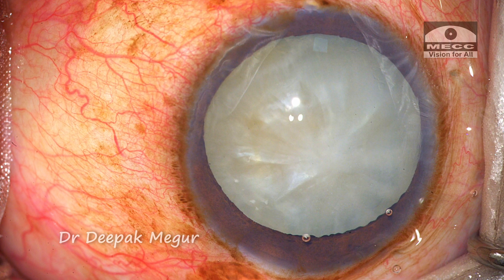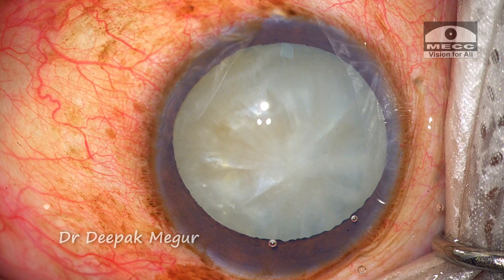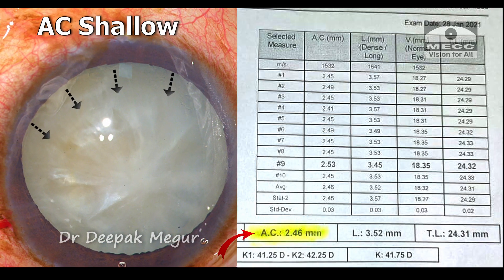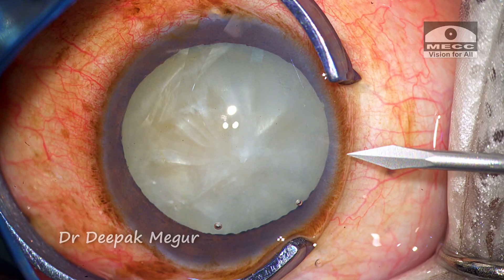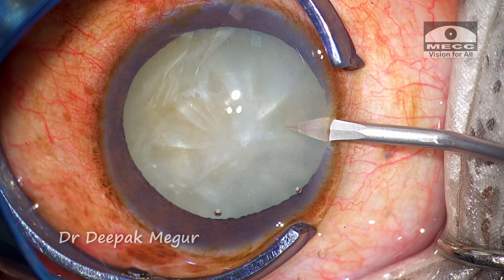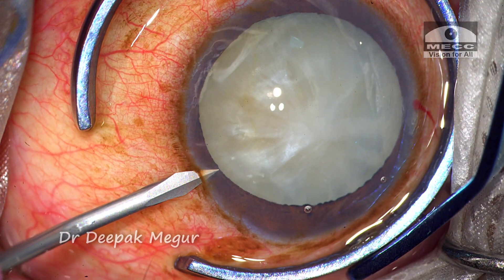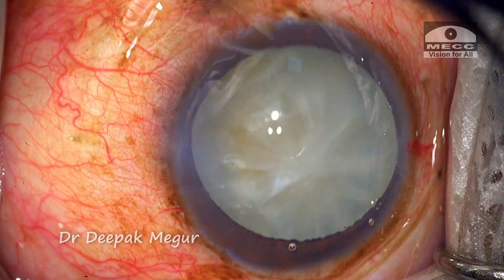This is an elderly gentleman with a long-standing mature cataract which has now become intumescent. The slit lamp evaluation revealed a very shallow anterior chamber. The pupils were not dilated initially for fear of him developing pupillary block glaucoma — a phacomorphic variant. He was administered IV mannitol prior to surgery, then the pupils were dilated and he was shifted to the operation room.